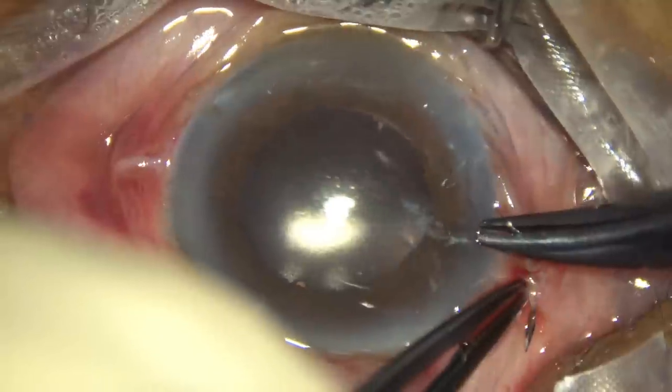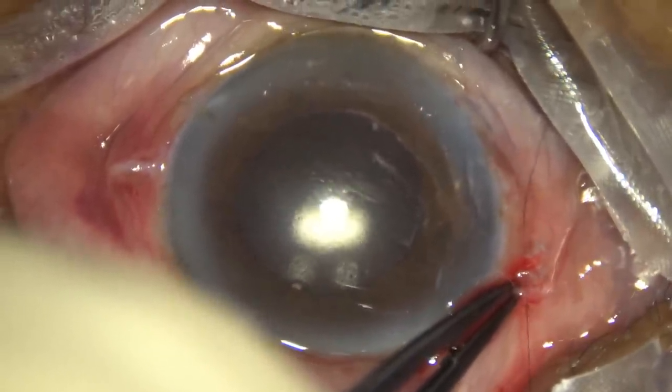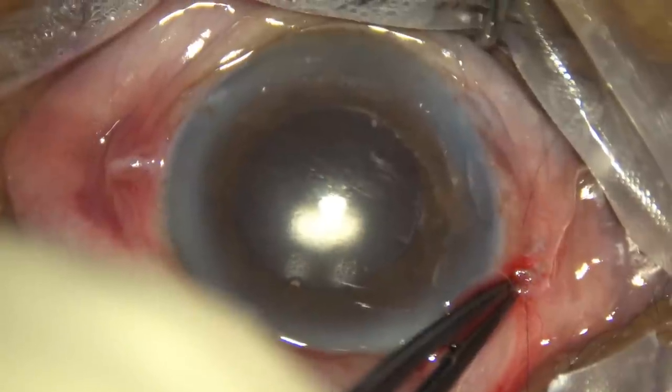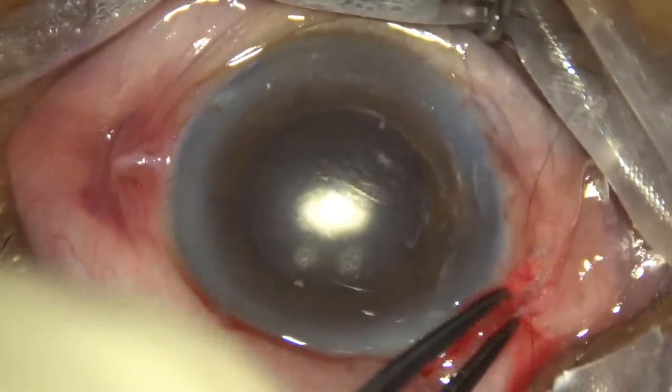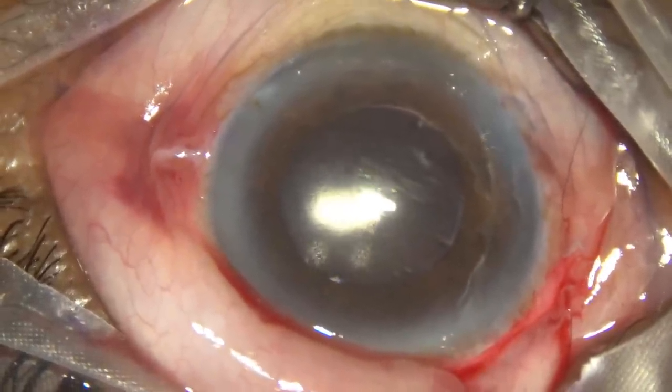This is a releasable suture at the right end of the peritomy. And this releasable suture can be removed after 3-4 days or at the next visit, say after 7 days.